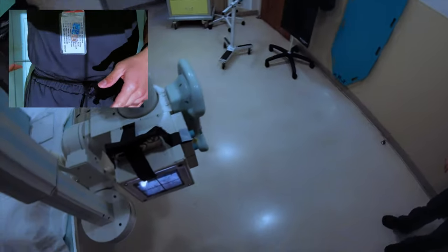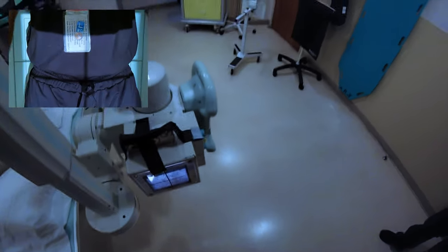Alright sir, so that's what we're going to have you do. I'm going to have you stand over here. Your back is going to be against this board. You're going to be facing this way. I'm going to get everything lined up to your height. And then once I do, you're just going to kind of pigeon toe here. And then I'll take the image, alright?